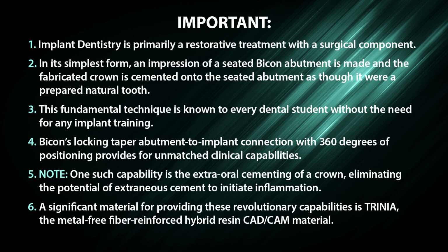In its simplest form, an impression of a seated Bicon abutment is made, and the fabricated crown is cemented onto the seated abutment, as though it were a prepared natural tooth. This fundamental technique is known to every dental student, without the need for any implant training.